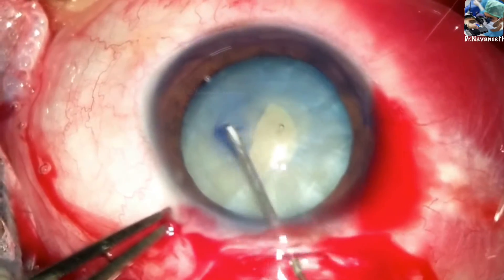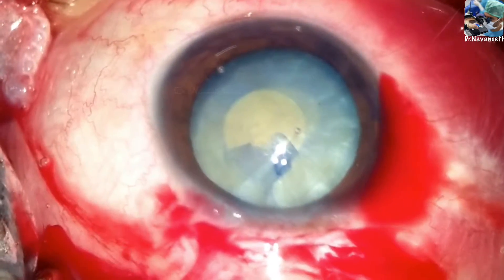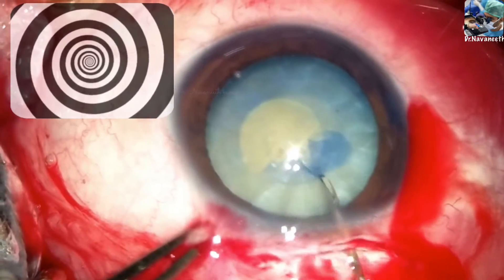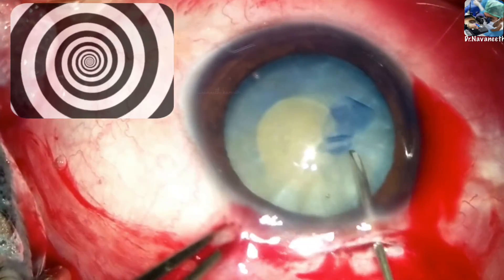Here, a small central flap is raised and moved in a spiral fashion. This spiral movement allows controlled movement of the flap, preventing the rhexis from running away.